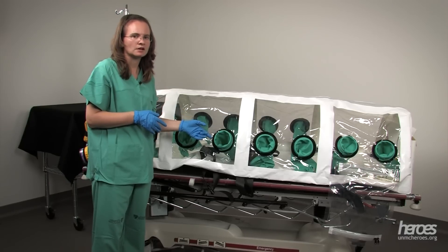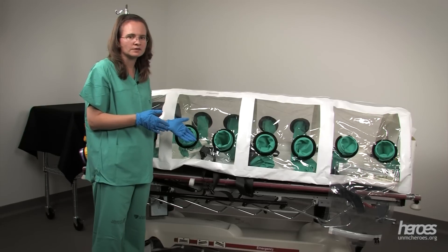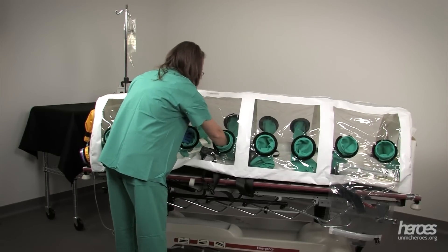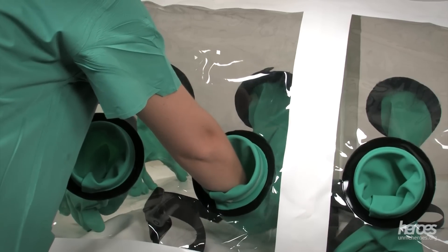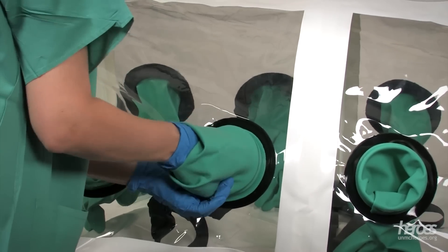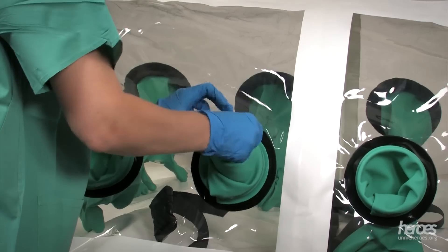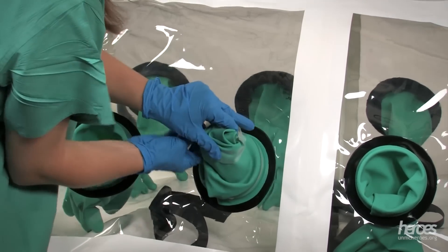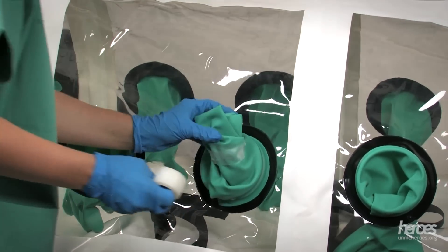You will find glove ports throughout your isopod. We should still use our normal patient care gloves inside the glove ports of the isopod. We can reach in and care for our patient inside the isopod using the clear areas to see what we're doing. If for some reason we breach that glove, we can gently remove our glove trying to keep the contaminated surfaces inside, gently twist the glove port, and then secure it with tape to prevent any contagion from leaving the isopod as well as maintaining the negative pressure seal.